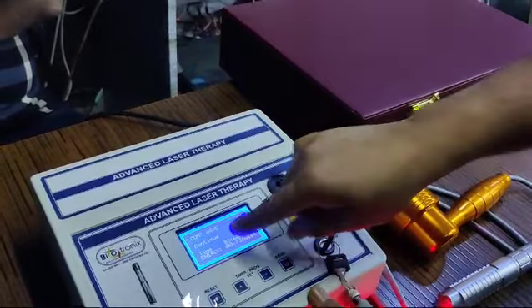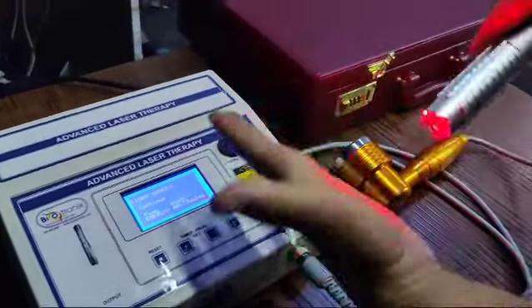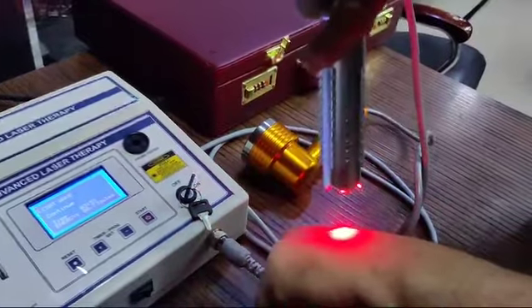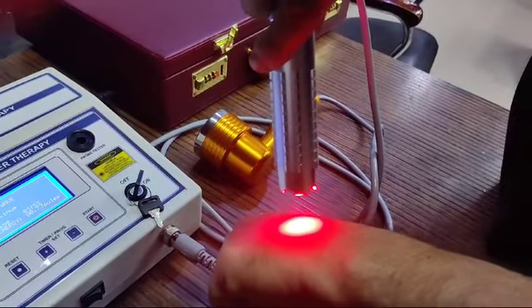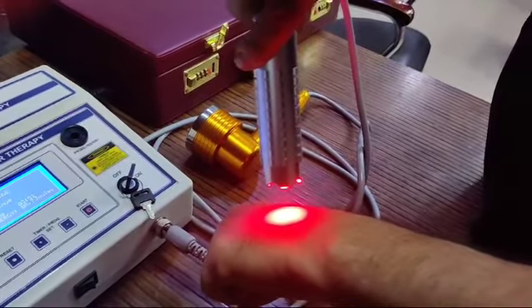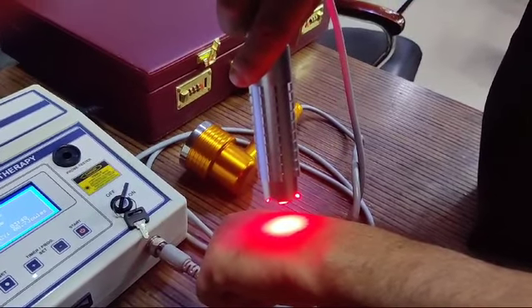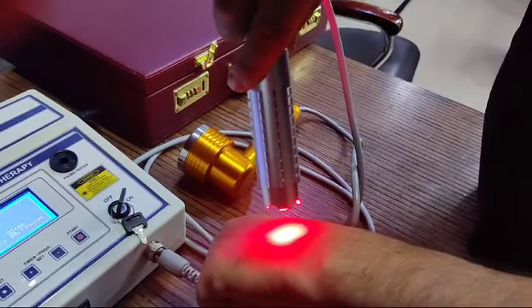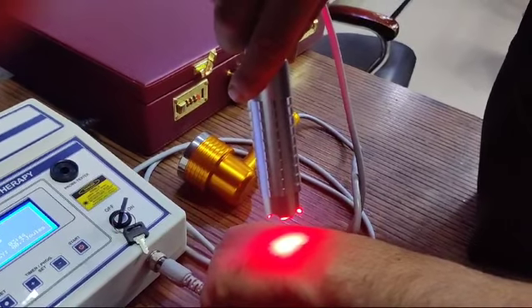I press the start key, the timer has started and the pointed probe, I am getting the laser input. This is the pointed probe and within 20 seconds I'm able to feel the heat. A gentle heat will come out.